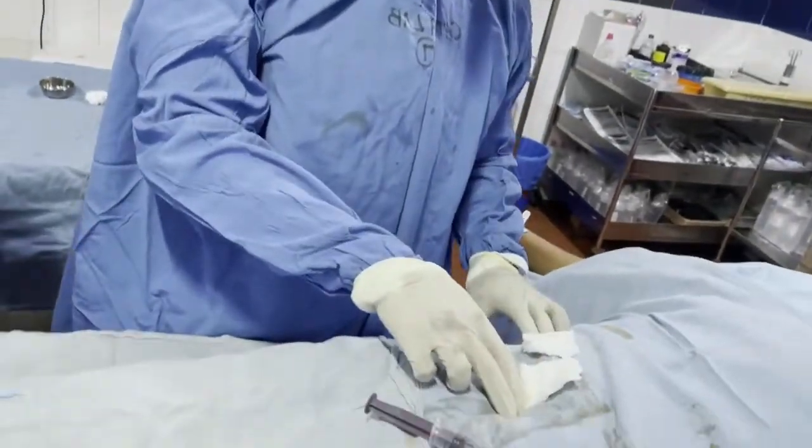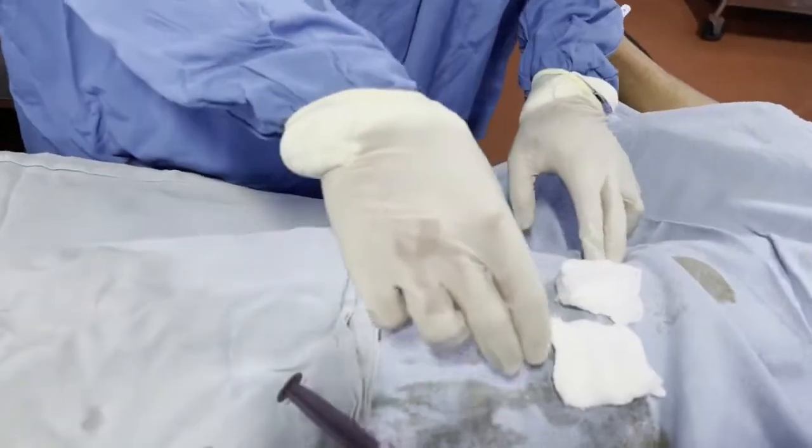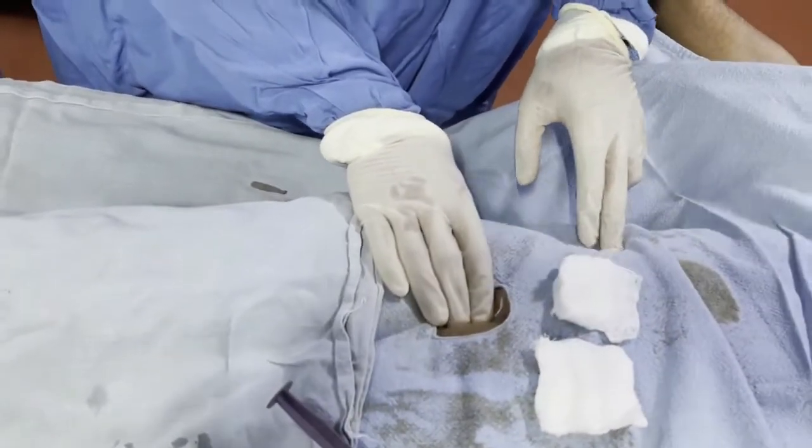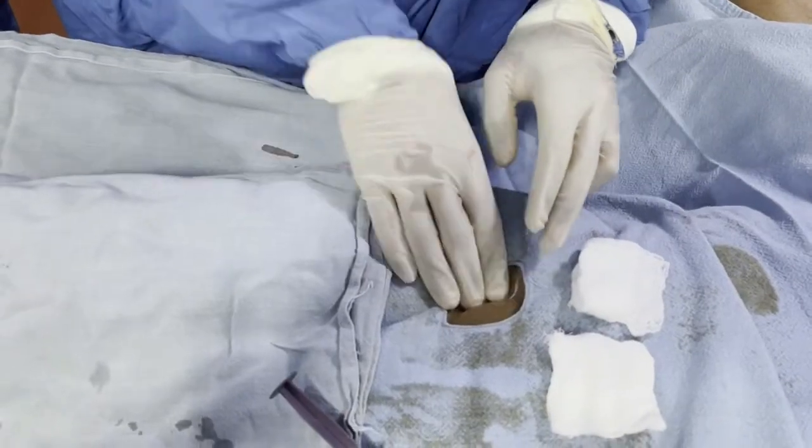Hello, welcome to DM Neurology MDC. I am Dr. Hamad Sviraj and let us see how to do a DSA through femoral approach. After palpating the anterior superior iliac spine and the pubic symphysis, we locate the femoral artery.